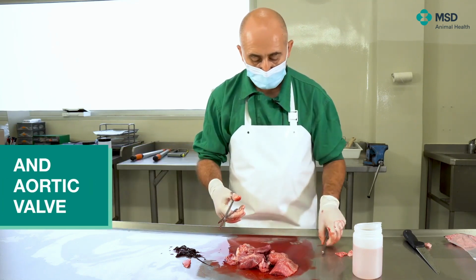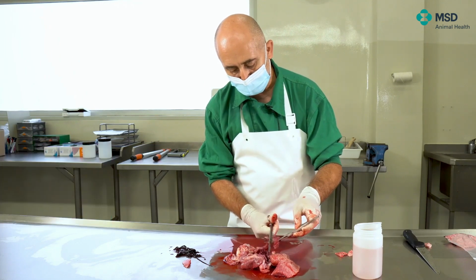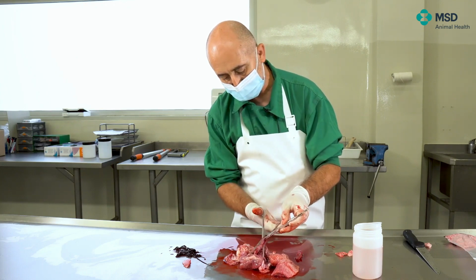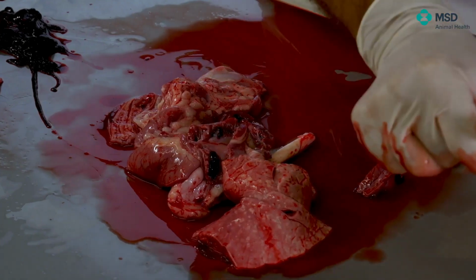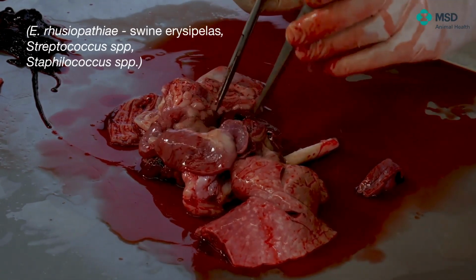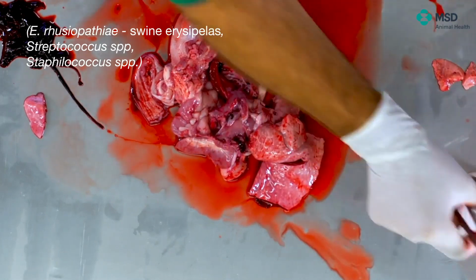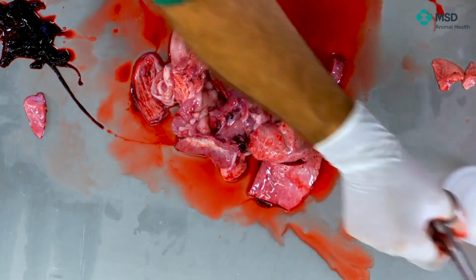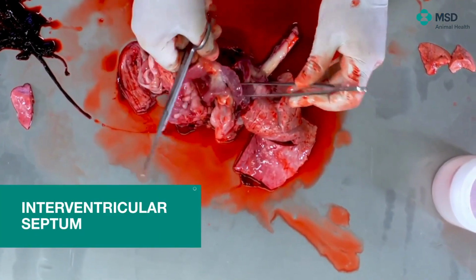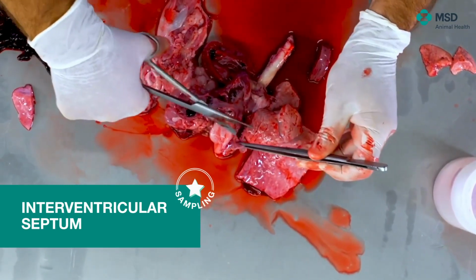And in case that we need to take some samples, especially for histopathological analysis from the heart, what we usually recommend is a piece of the ventricular wall, again, a small piece that we can fix easily in a formalin can, and sometimes also a small piece of the atrium. So that way, we have both a piece of atrium and ventricle.